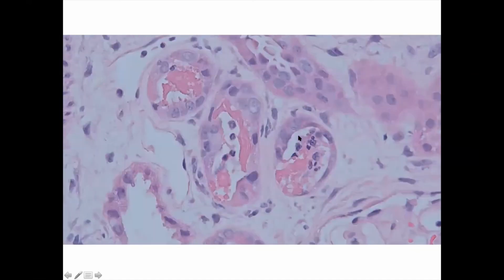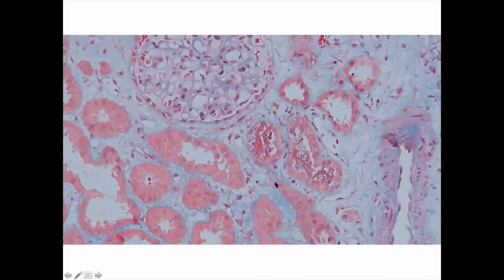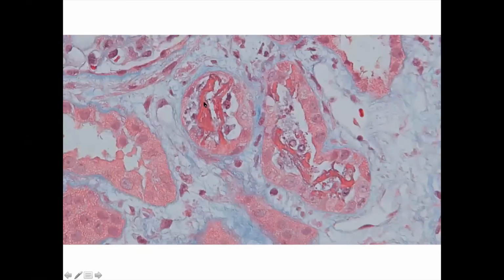Again, this is a close up of these casts, and they're not fractured. And I'm stressing on the fact that they are not fractured. Okay, they're highly eosinophilic. And this is trichrome, and they are red. They are brick red, extremely reddish in color. Okay, ساعات يكونون brown red, ساعات يكونون brick red, maroonish. Okay, close up, just to appreciate how deep red they are.